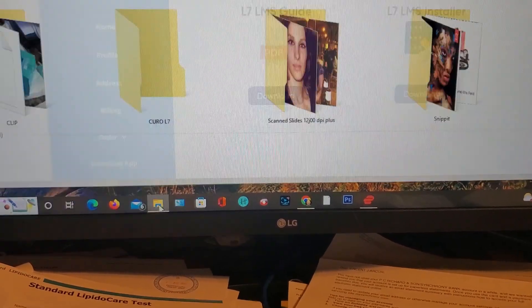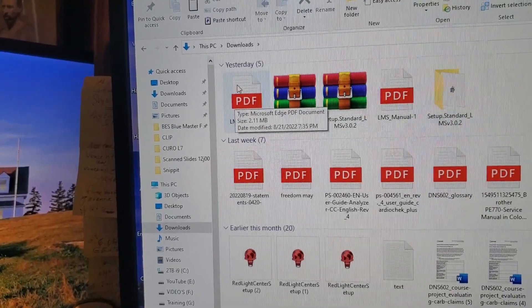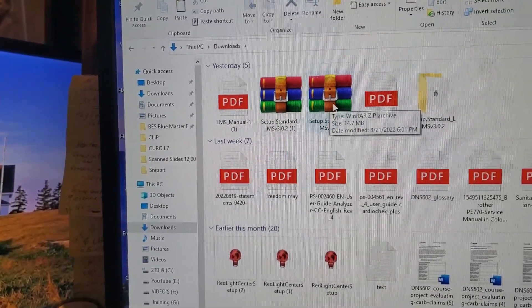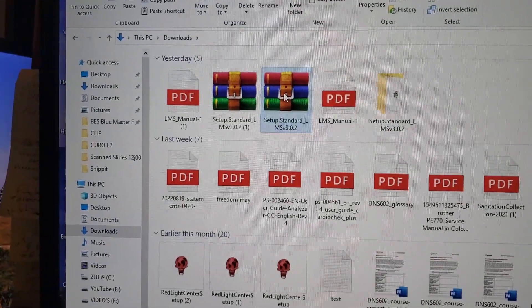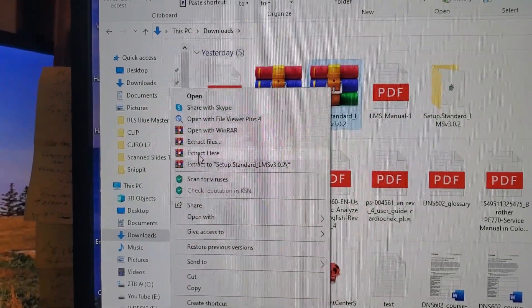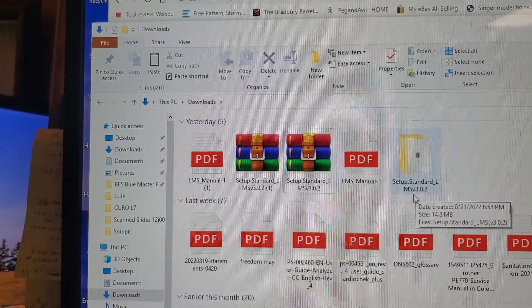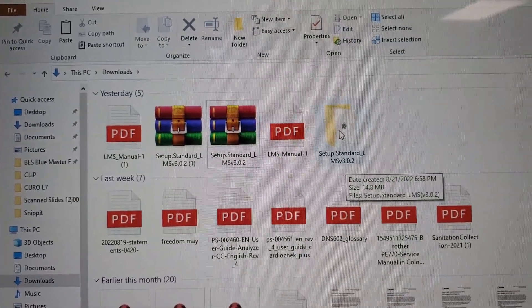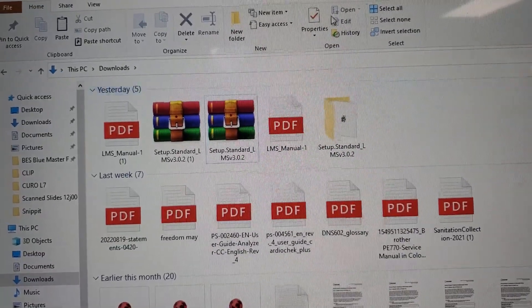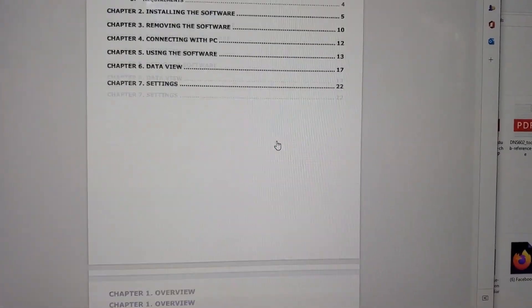I come down here and open up my folders. I left click on Downloads. Here's the manual and here's the setup. What I did was I opened up the folder — you left click and you could extract here or extract files. I wound up with MSV 3.0.2 — that's the installation folder. And here's the manual.